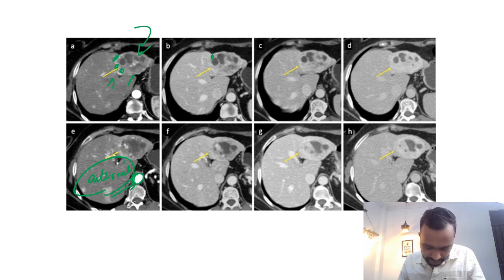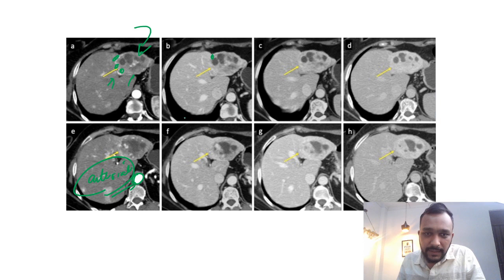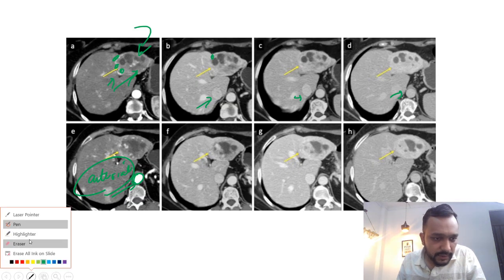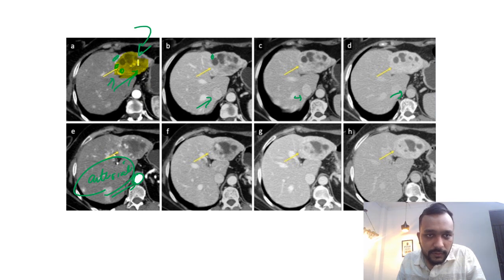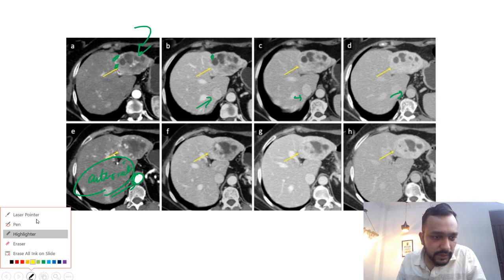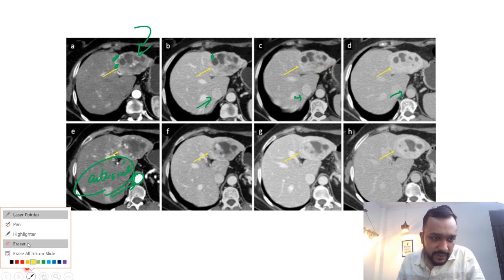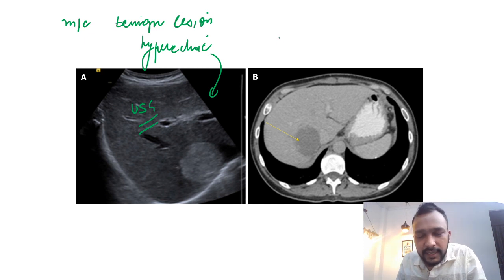If you look at the enhancement of the aorta, you can very well identify that this is an arterial phase. In the portal venous and delayed scans, you will see that this portion of the lesion is showing progressive enhancement. Because of this progressive enhancement, this is a case of hemangioma.